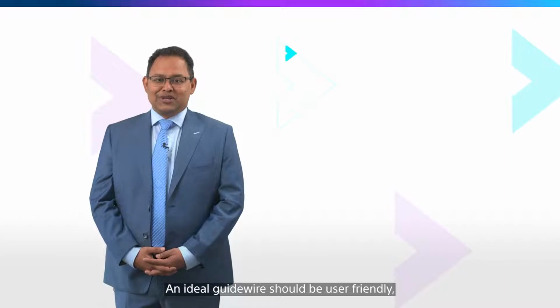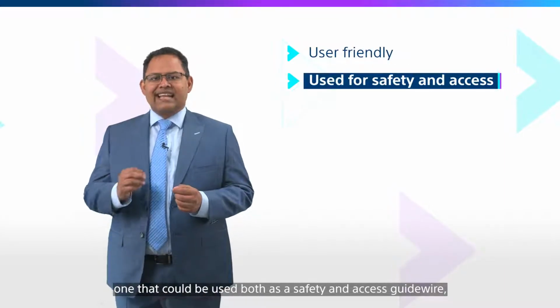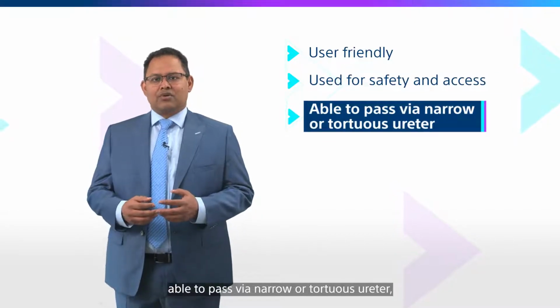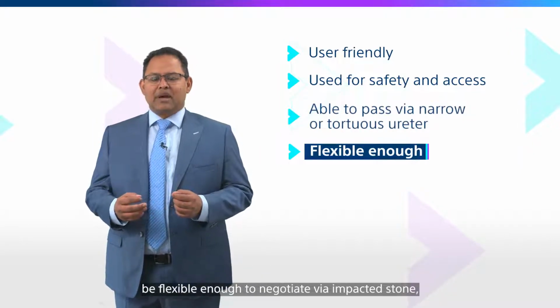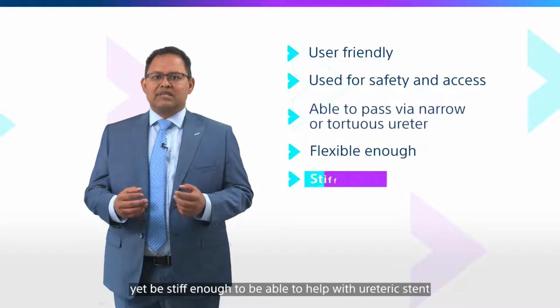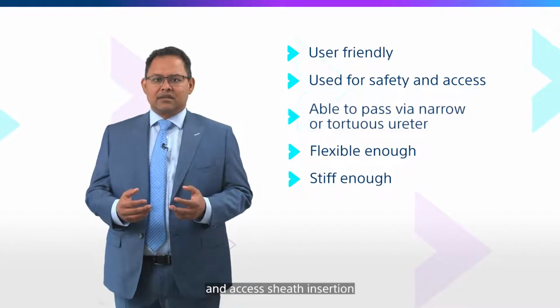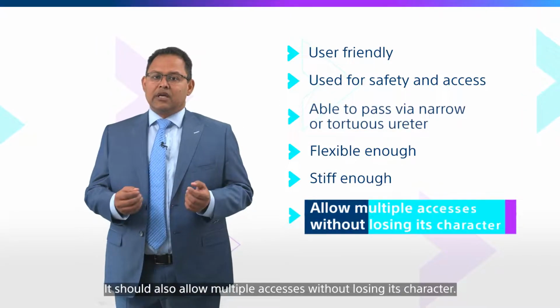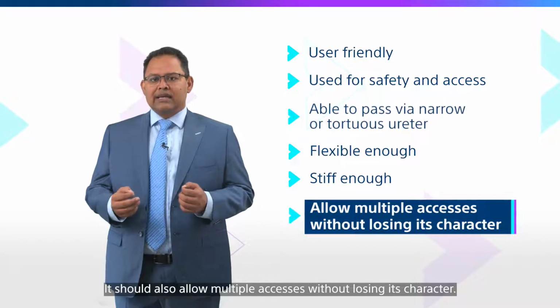An ideal guide wire should be user-friendly, one that could be used both as a safety and access guide wire, able to pass via a narrow or tortuous ureter, be flexible enough to negotiate an impacted stone, yet be stiff enough to help with ureteric stent and access sheath insertion over it without the need to swap to a different wire. It should also allow multiple accesses without losing its character.